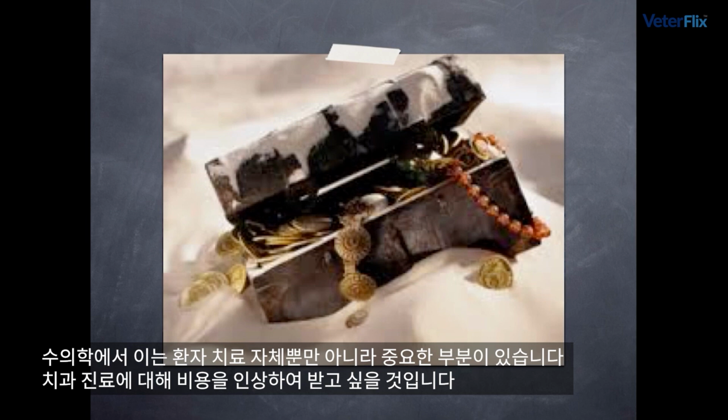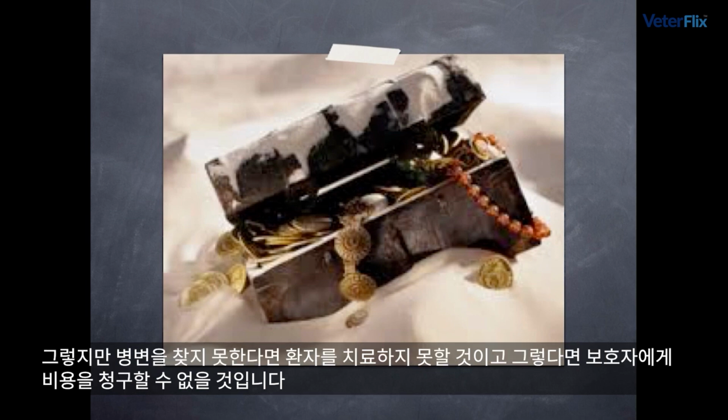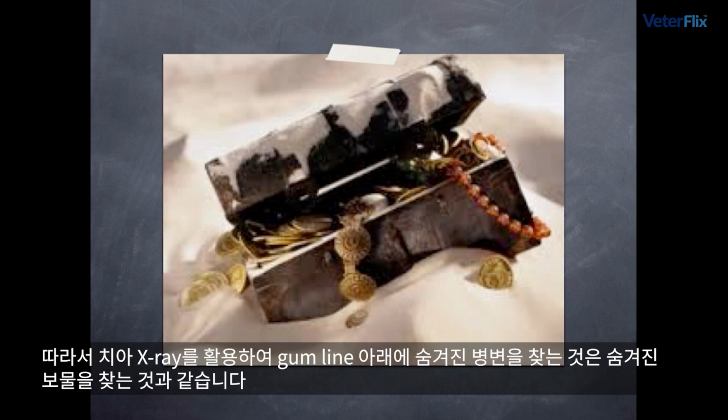We want to have up-to-date equipment in our hospital, and the way that we do that is by becoming financially successful, and dentistry is absolutely one of those ways to do that. But unless we're finding that pathology, we can't treat it, and we can't charge for it. So we want to make sure that we're finding all of that hidden treasure and that hidden pathology beneath the gum line with dental x-ray.